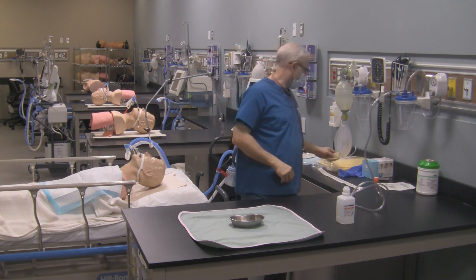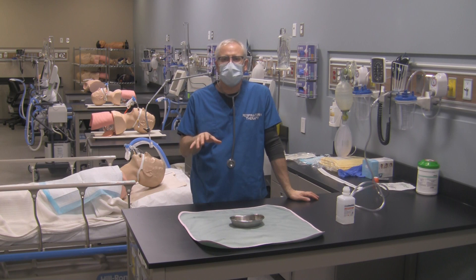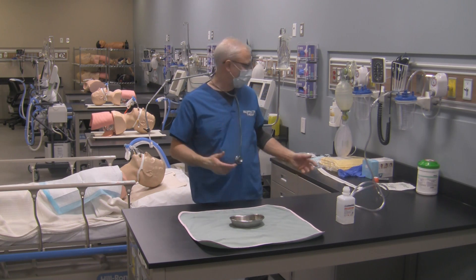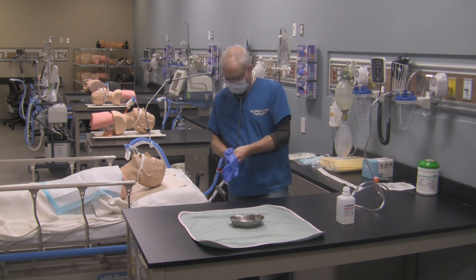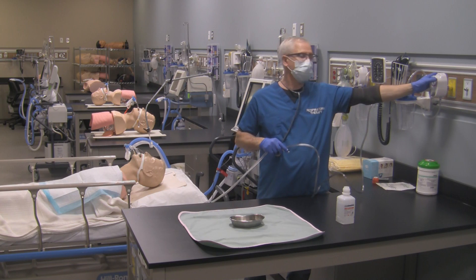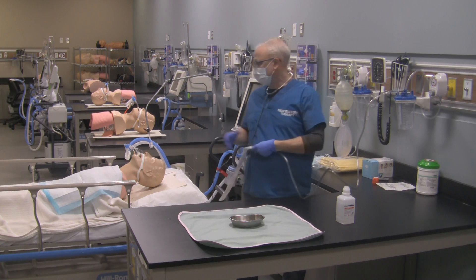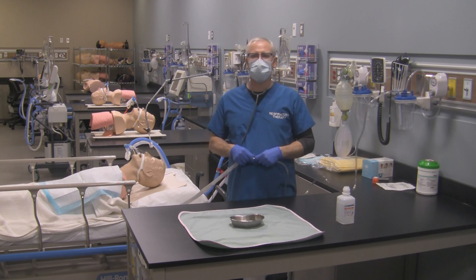I'm not going to demonstrate pharyngeal suctioning here because I've shown that in another video. At this point you would put your clean gloves on, grab your new suction catheter, hook it up to your suction tubing, and switch your regulator to full line pressure — because now you're going to pharyngeal suction your patient's airway and clean out their oral cavity, oropharynx, and hypopharyngeal area.